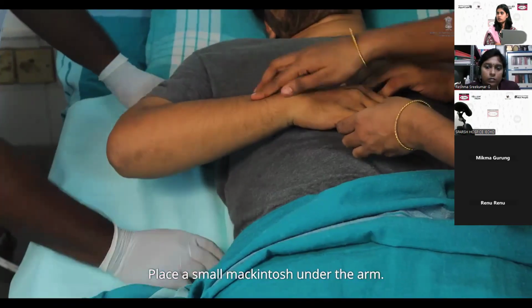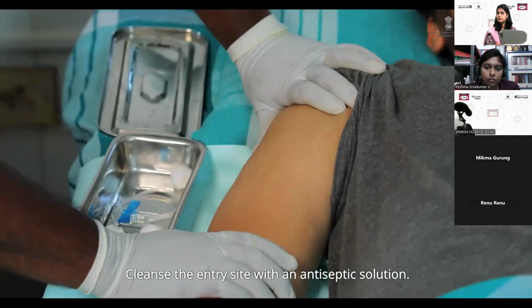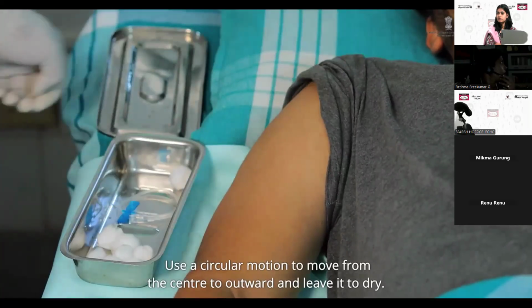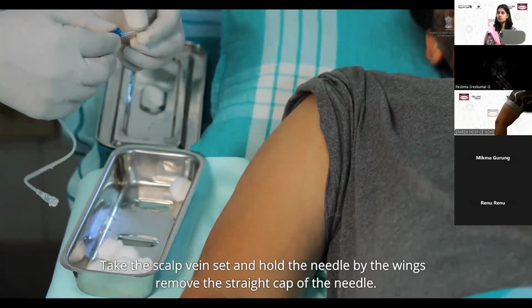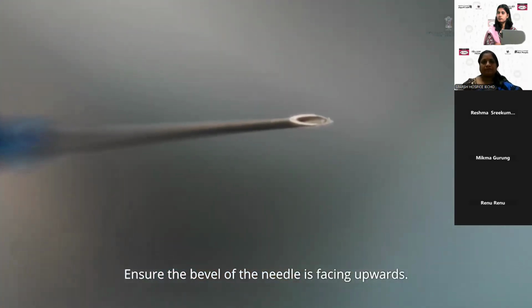Place a small Macintosh under the arm. Cleanse the entry site with an antiseptic solution. Use a circular motion to move from the center to outward and leave it to dry. Take the scalp vein set and hold the needle by the wings. Remove the straight cap of the needle. Ensure the bevel of the needle is facing upwards.